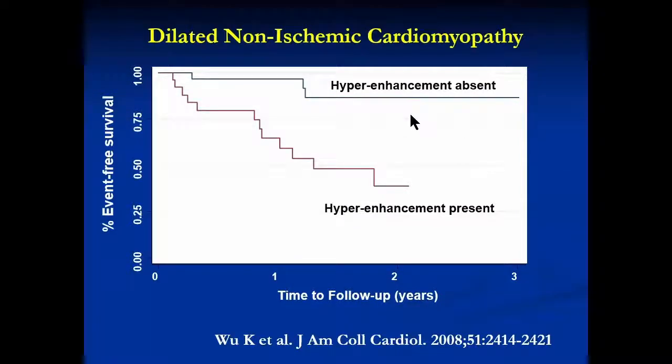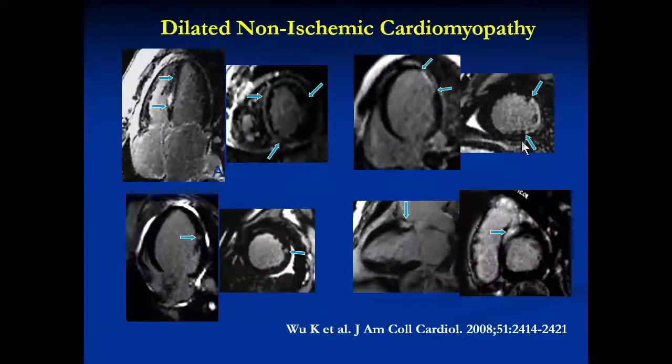This situation is actually very uncommon. So the question of no delayed enhancement, but it happens. And the prognosis is much better. So a lot of dilatation, a lot of dysfunction, no delayed enhancement, better prognosis.